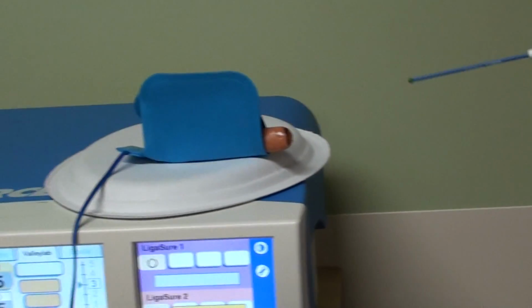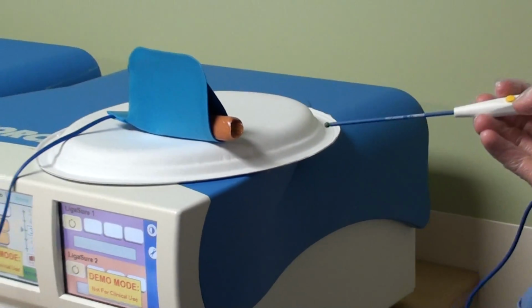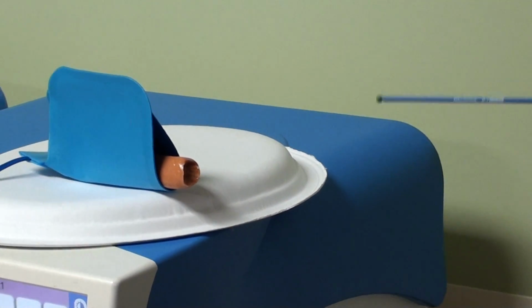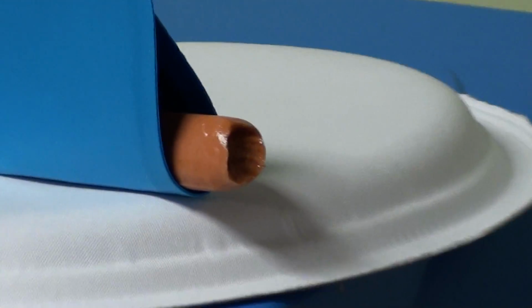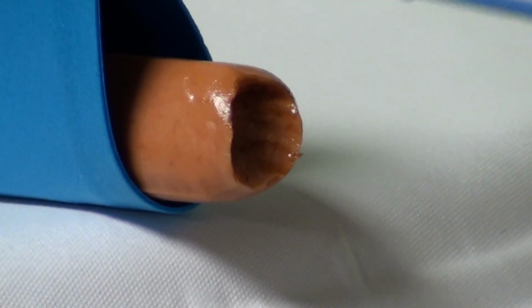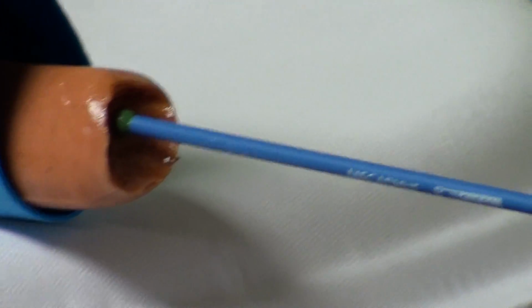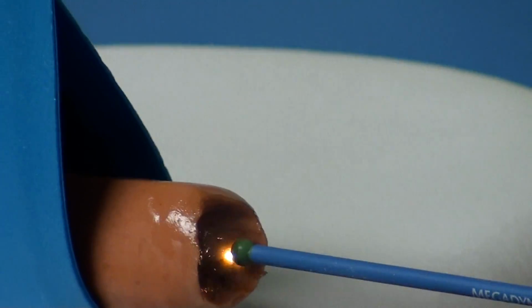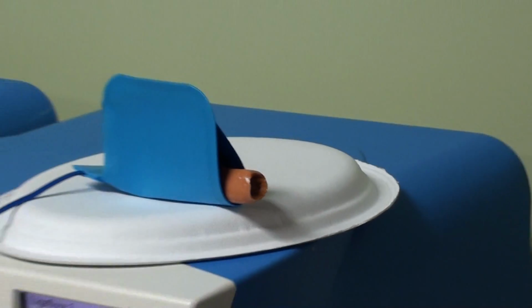And so to achieve hemostasis there, you could either use fulguration or you could use desiccation. And again, desiccation can be achieved using either the cut or the coag button in the contact technique, or fulguration using the coag button in the non-contact. So we'll use desiccation because let's say it's bleeding quite a bit. So we'll contact the tissue and use the coag button so we can get a deeper coagulation of the tissue. And that would help you achieve hemostasis.